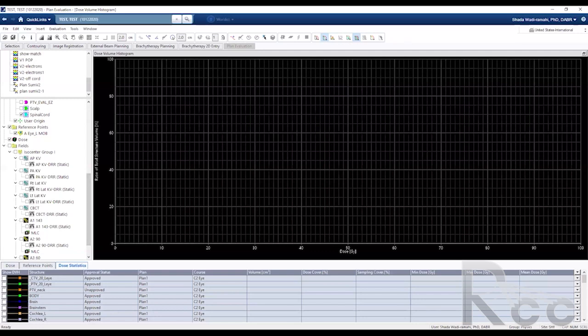In my clinic, we have to be concerned with the plan to check the coverage and the consistency of the isodose lines in the plan. The DVH will give you, like, 95% getting 95%. But if you check through the plan, through the slices, you find that the coverage is not so consistent. So that's why you have to be concerned with the consistency of the isodose lines in the plan. Thank you. I agree with you 100%.